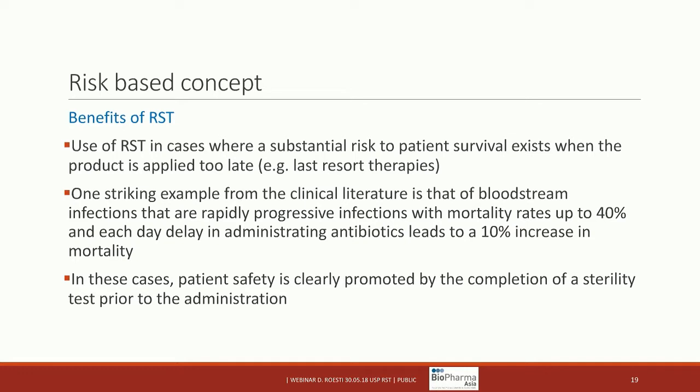There have been some literature reports that when there are blood infections, every daily delay in providing antibiotics increases the mortality rate by 10%. So every hour counts in this case. If you can provide the answer that your product is clean, it's sterile, prior to administration to the patient, and provide it as fast as possible, there is a clear safety benefit for the patient here.